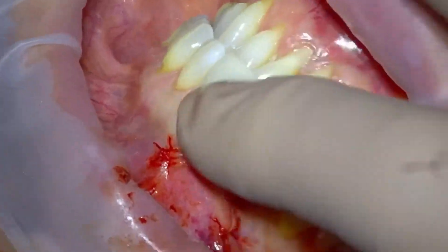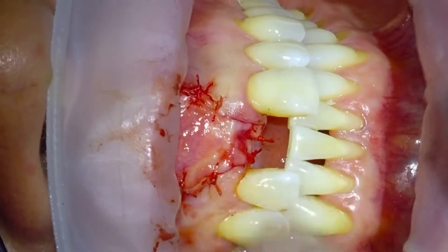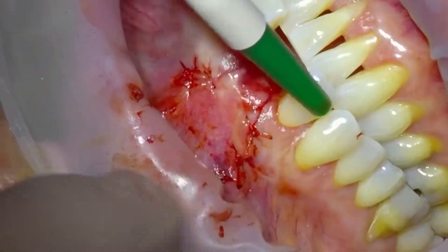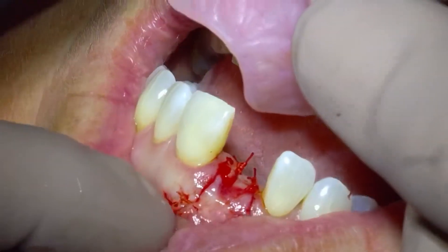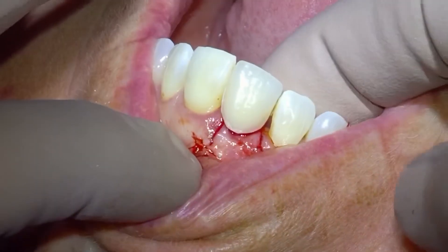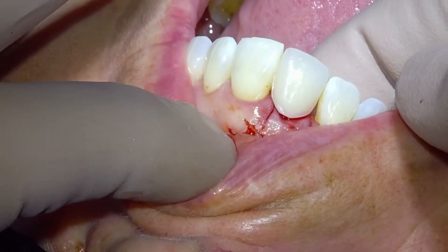And that's our implant surgery done in the aesthetic zone. We'll leave that typically for 10 to 12 weeks to just really mature. And then obviously always check that your dentures aren't going to impinge, and you'll likely need to adjust the fitting surface of the denture.